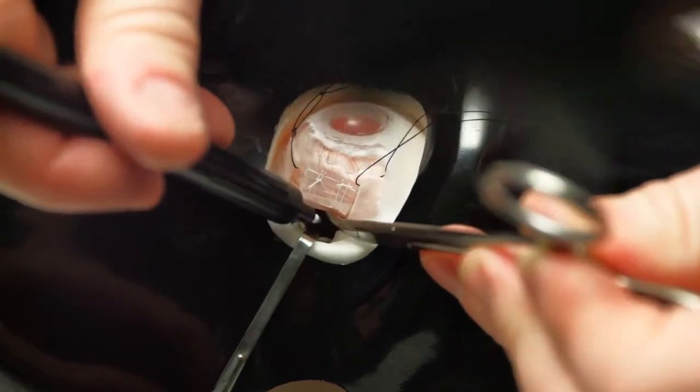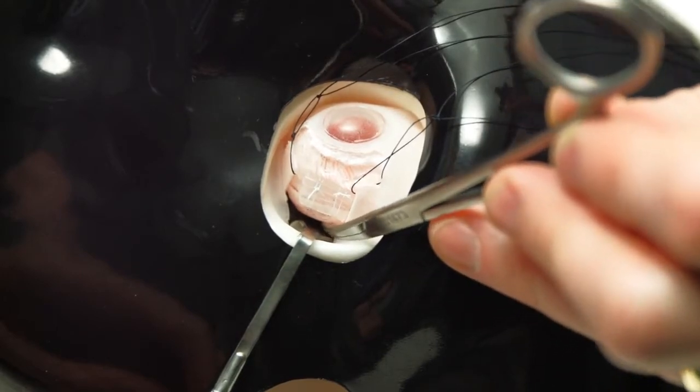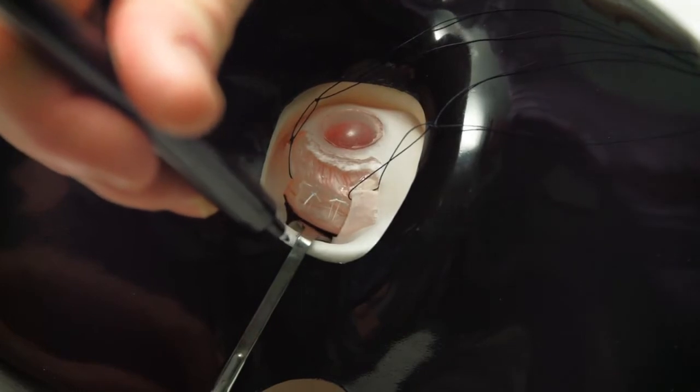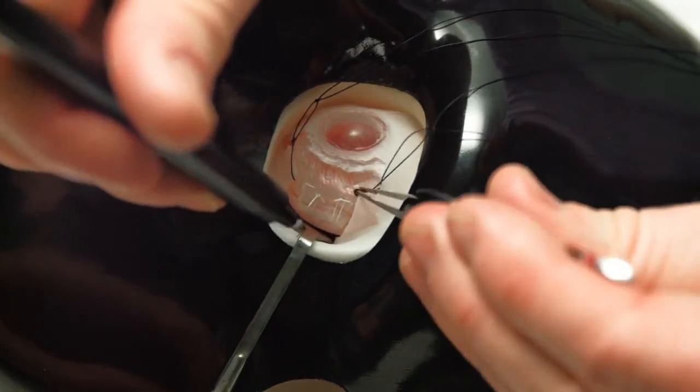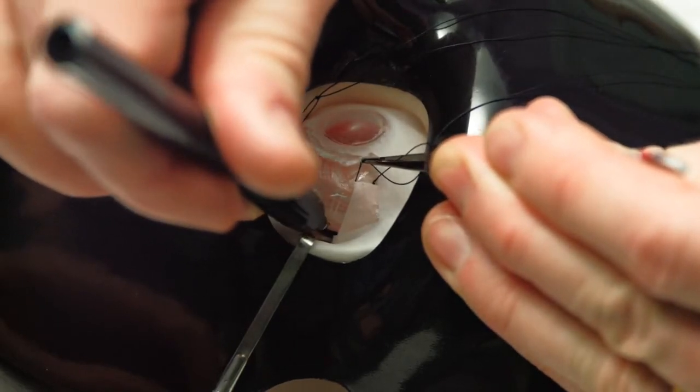The tip of the curved artery clip should be visible internally with pressure, and the location of the drain should be the point where the subretinal fluid is nice and deep. We can mark on the outside of the eye on the sclera where the subretinal fluid is deep.